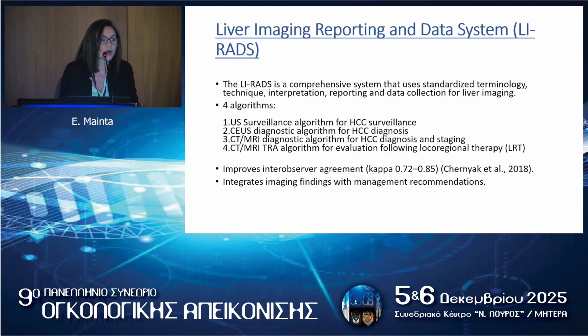It includes 4 algorithms: the ultrasound surveillance algorithm for HCC surveillance, the contrast-enhanced ultrasonography diagnostic algorithm for HCC diagnosis, the CT and MRI algorithm for diagnosis and staging of HCC, the CT and MRI tumor response assessment, which is an algorithm made in order to evaluate lesions after locoregional therapies.